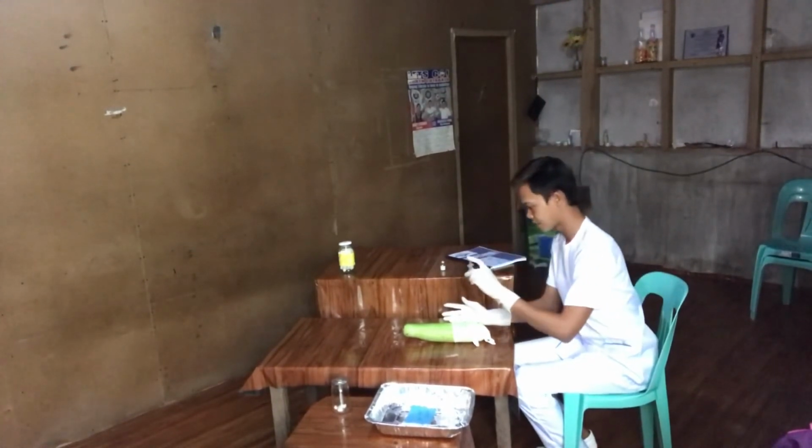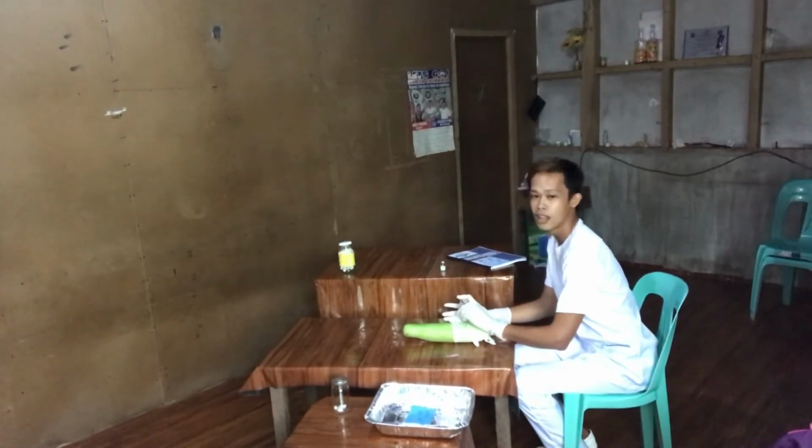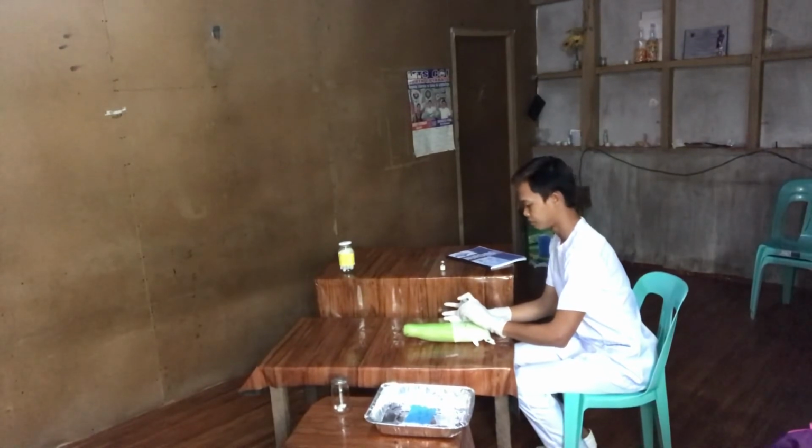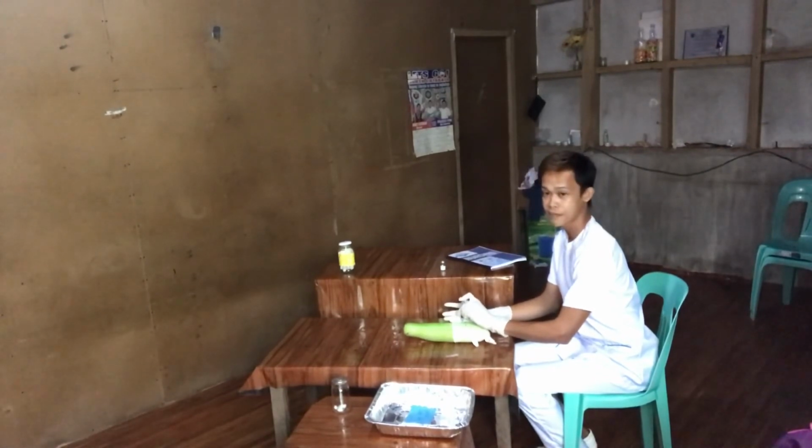Something like this. We need to do it quickly to cause the patient less pain. We want to be steady.